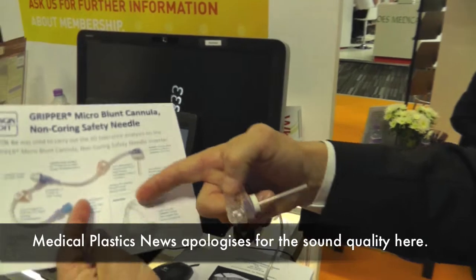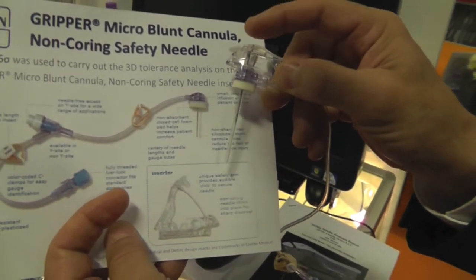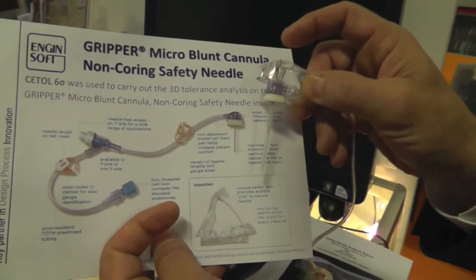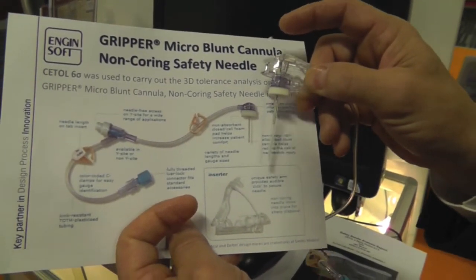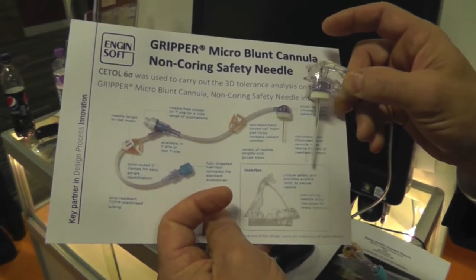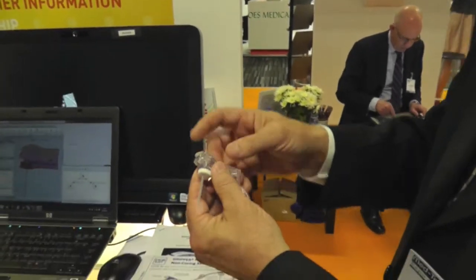What happens in here, though, as you can see in the document, is there is a snap. This entire top end will snap down, and what it's doing is making sure that the penetration of the needle and that the seating of the needle is correct, and you still have a good seal. You want to make sure the patient cannot cause a problem. So there are design features about the snap that are critical to the safety of this device. And this is what the company wanted to discover, what kind of robustness issues might they have with this when they go to manufacturing. Okay, do you want to show me on here the moving parts that you were talking about? Okay.